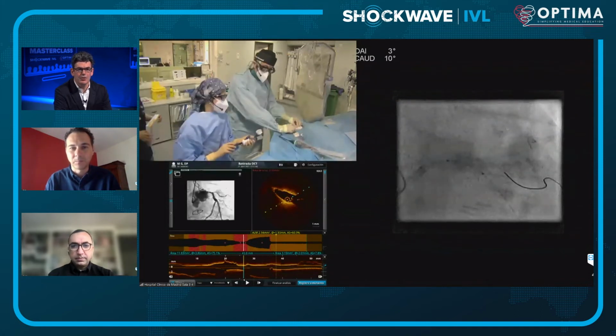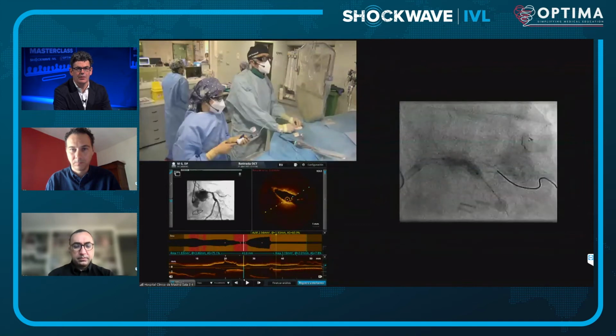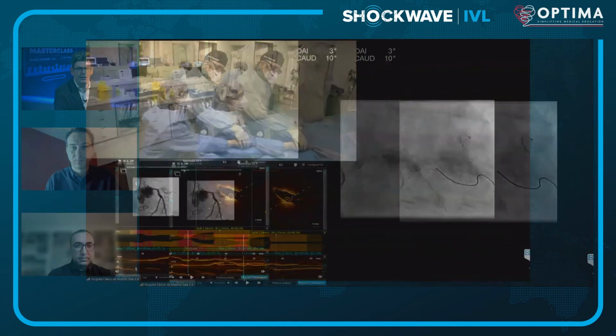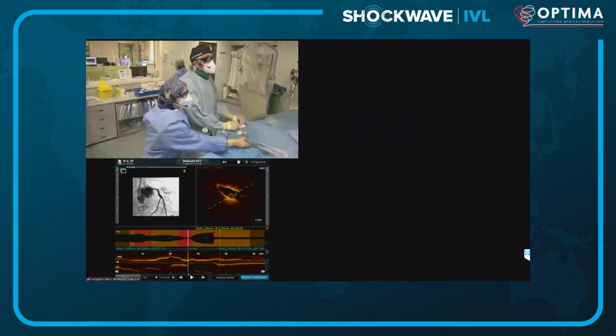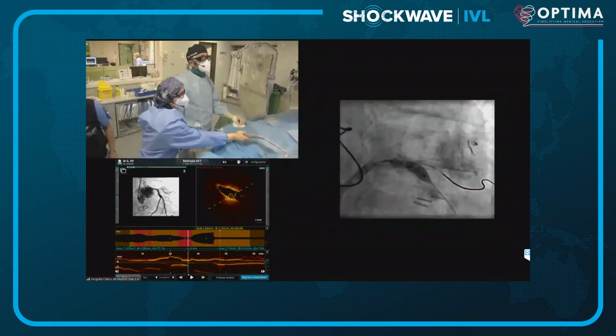Can you just show us maybe an acquisition or just a high resolution? Okay. So we can still see that waist to a degree. But it's improving a little bit. Yeah, it's better. So we then need to move a bit more proximal, yeah. I think it's much better, yeah.